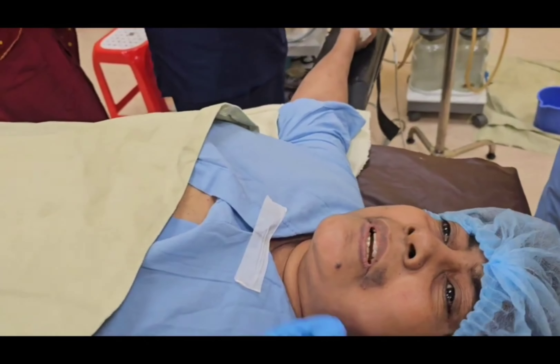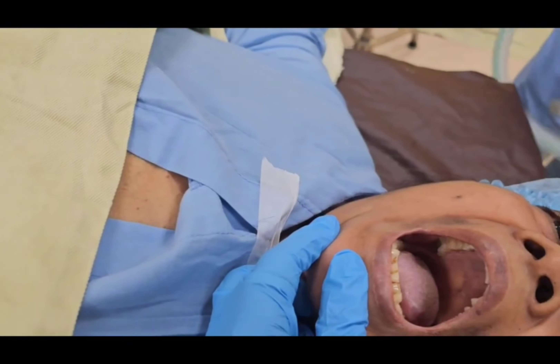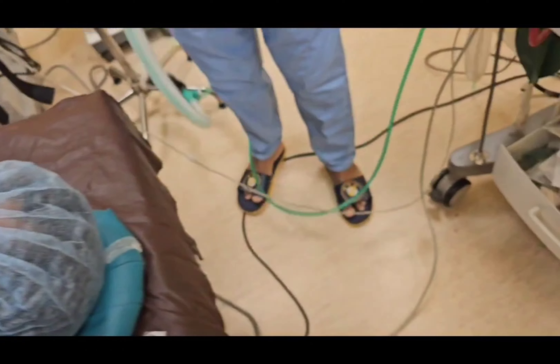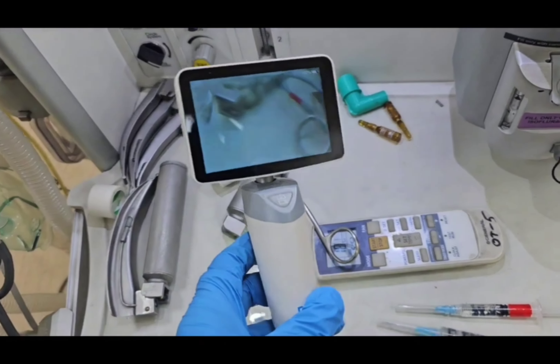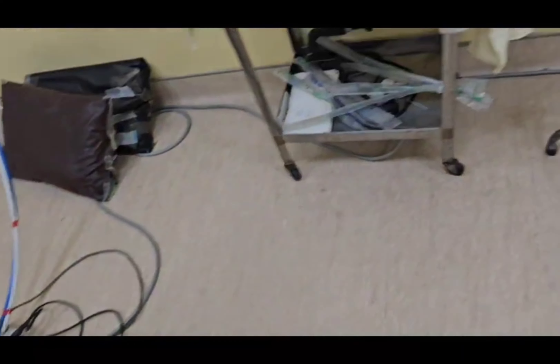We are taking consent from the patient and checking if the uvula is visible. As the uvula is not visible, we will go for video laryngoscope. We have already prepped that.